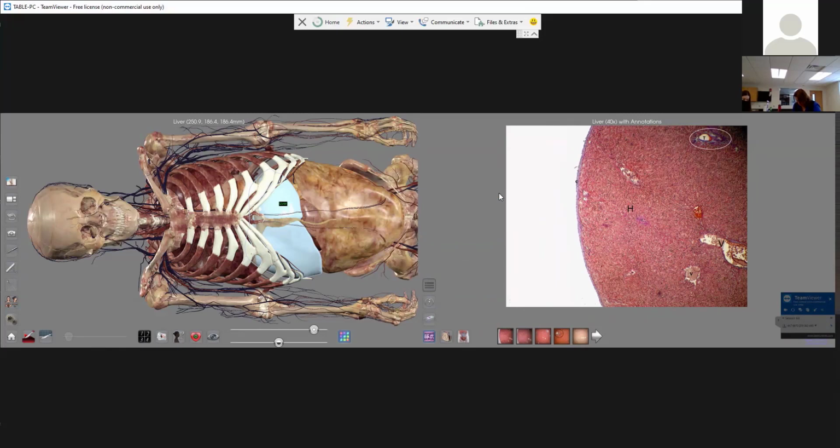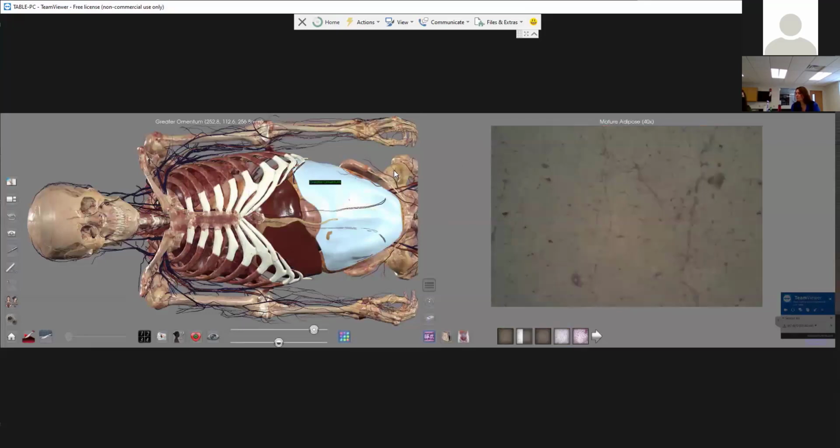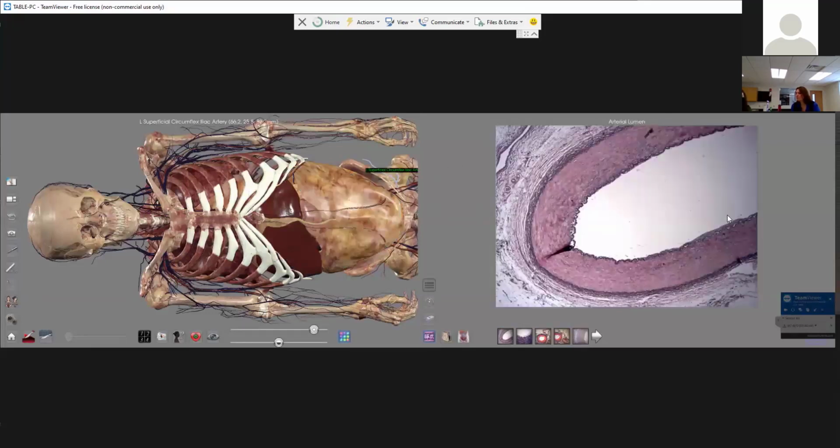It is important to note that these slides are not from our actual cadavers. So if you're expecting maybe some kind of cell irregularity because this cadaver has leukemia, these aren't their cells. They're donated or otherwise acquired, but they are linked so you can compare them. Normal.